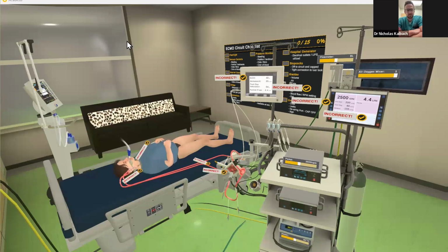That's great. So I presume, Rick, you're going to be my visual guide in order to get people seeing what they need to see. But as Dr. Slamon was saying earlier, this is our late teen pediatric patient who is currently, based on everything I'm seeing, most likely on VV ECMO. If we were to get a little bit closer from a camera standpoint towards the actual cannulation site.